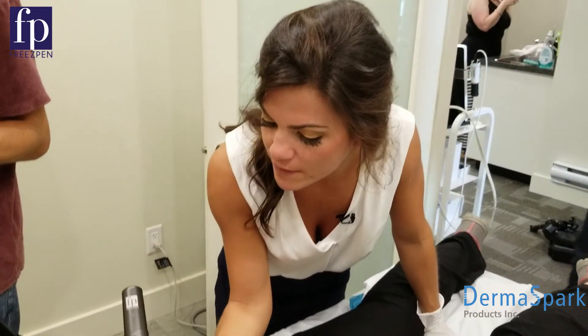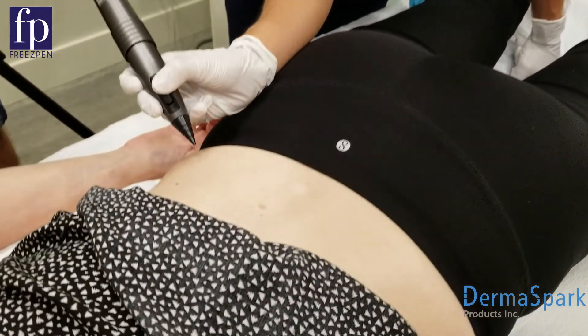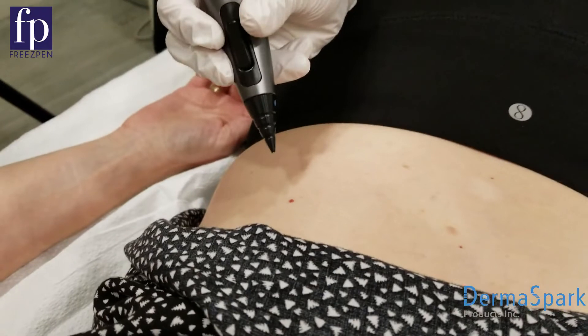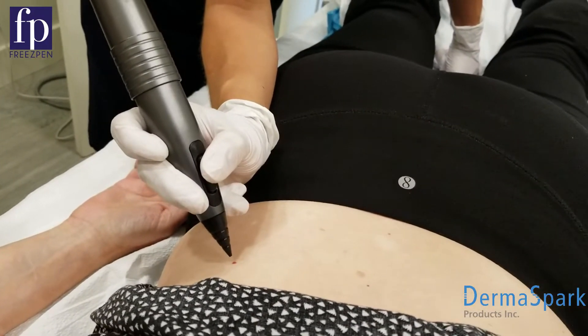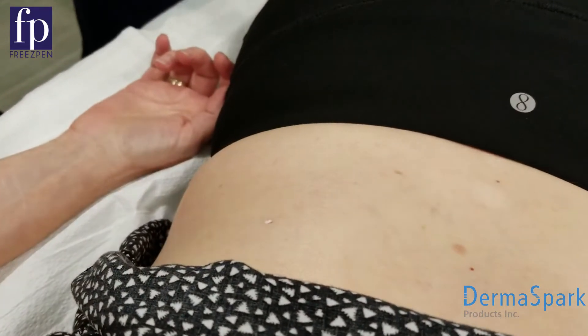Today we're going to be treating this cherry angioma. It's going to be a very short treatment time — about three seconds. We're going to use the freeze pen, which takes a nitrous oxide cartridge and runs at negative 89 degrees Celsius, negative 127 Fahrenheit. I'm going to keep it at a 45-degree angle.